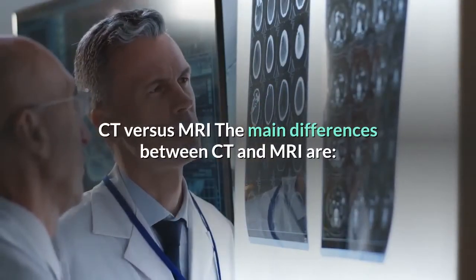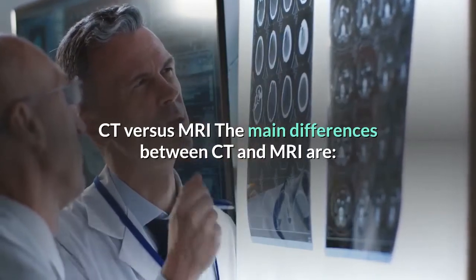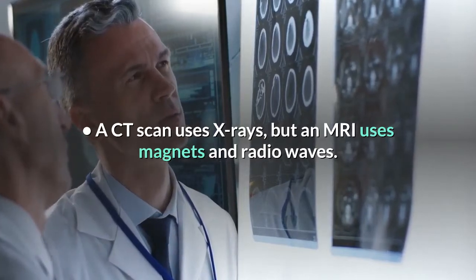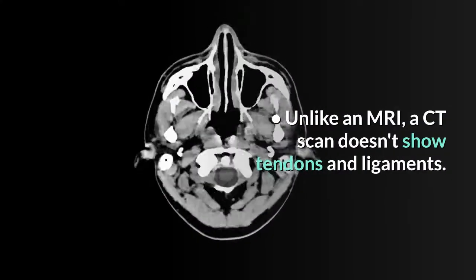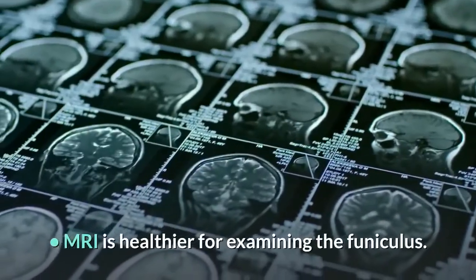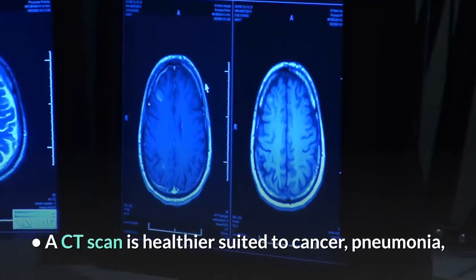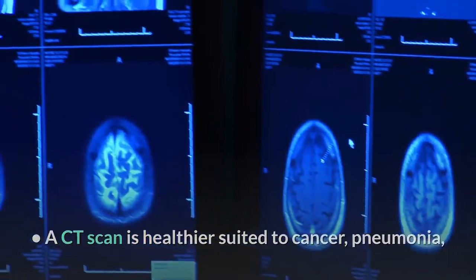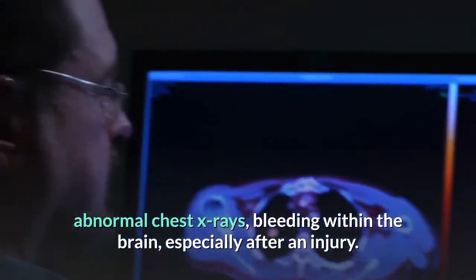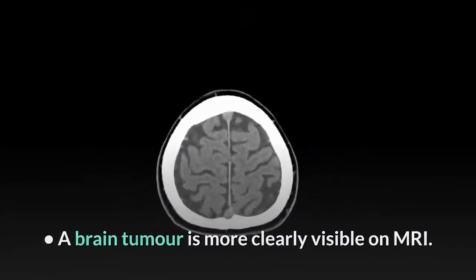CT versus MRI. The main differences between CT and MRI are: a CT scan uses X-rays, but an MRI uses magnets and radio waves. Unlike an MRI, a CT scan doesn't show tendons and ligaments. MRI is better for examining the spinal cord. A CT scan is better suited to cancer, pneumonia, abnormal chest X-rays, and bleeding within the brain, especially after an injury. A brain tumor is more clearly visible on MRI.